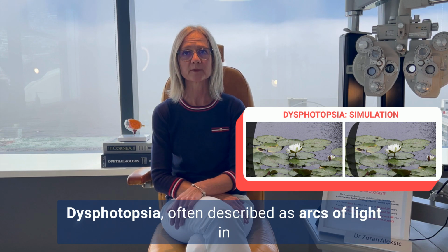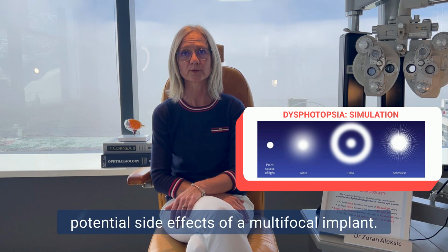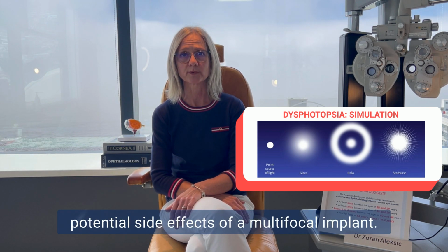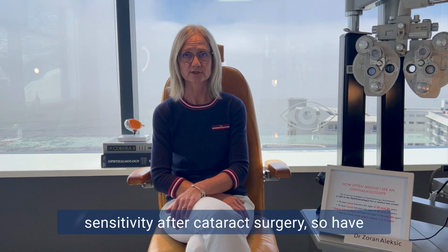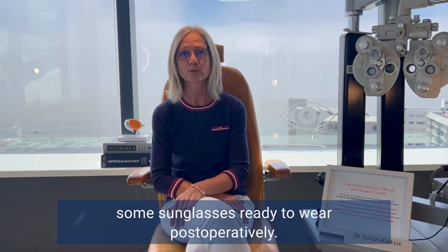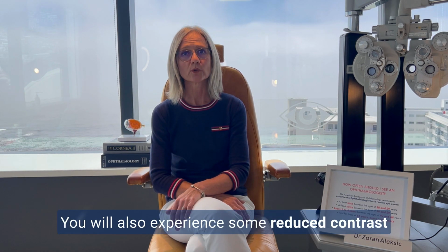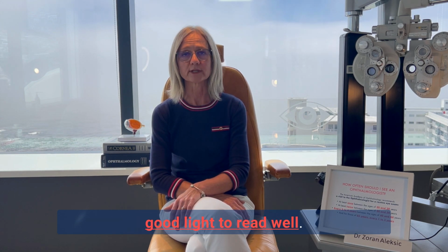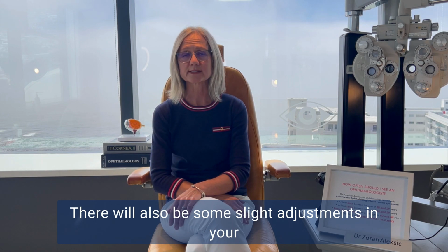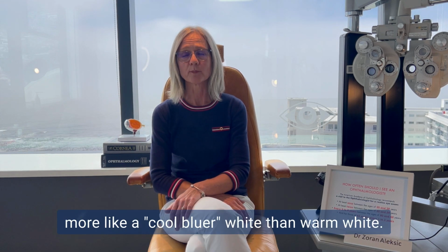Dysphotopsia, often described as arcs of light in the peripheral vision, streaks or starburst, are also potential side effects of a multifocal implant. Most people will experience increased light sensitivity after cataract surgery, so have some sunglasses ready to wear post-operatively should you experience increased light sensitivity. You will also experience some reduced contrast sensitivity, which means that you will need good light to read well. There will also be some slight adjustments in your color perception, and most people report that things look more like a cool bluer white than warm white.